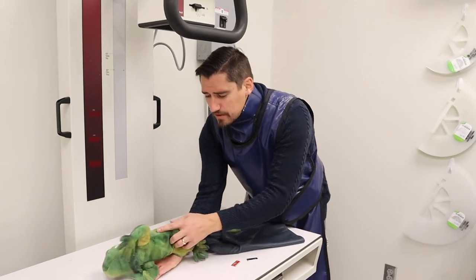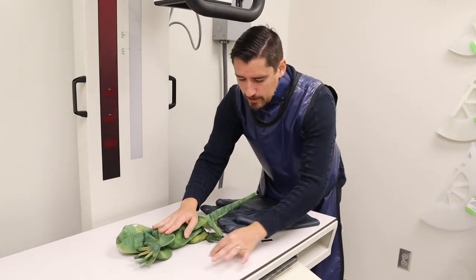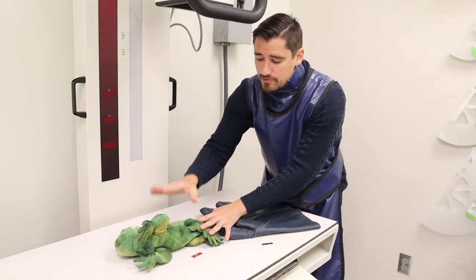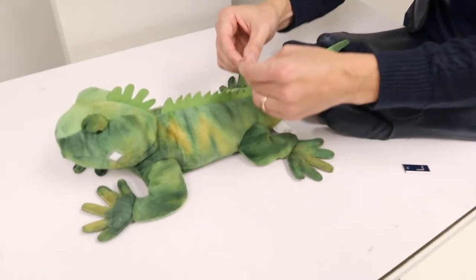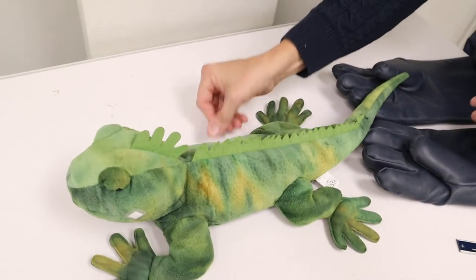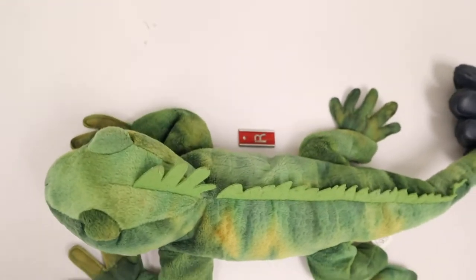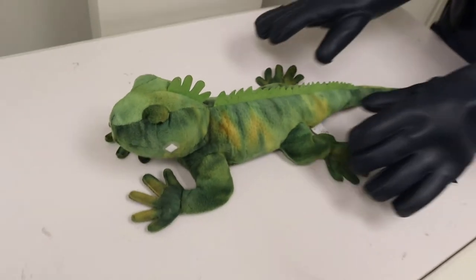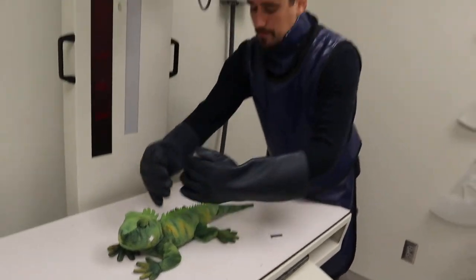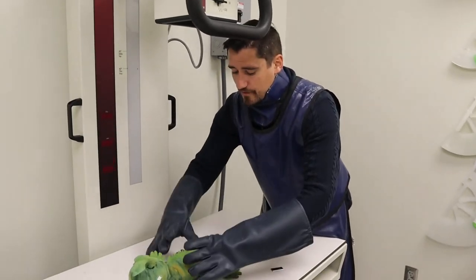When I x-ray, if I put him on his right side, I'm going to put the R next to him so I know I'm shooting on his right side. If he's on his belly, I'm going to put the R over here. So now that we're getting ready, I'm going to turn the machine on, line him up, and make sure the x-ray focuses on his belly.